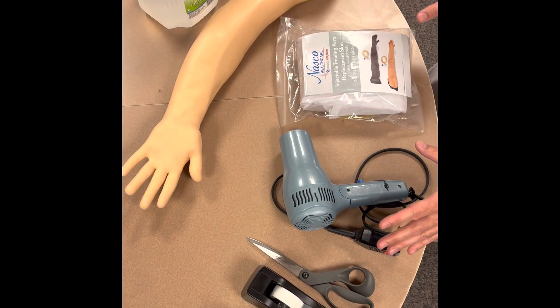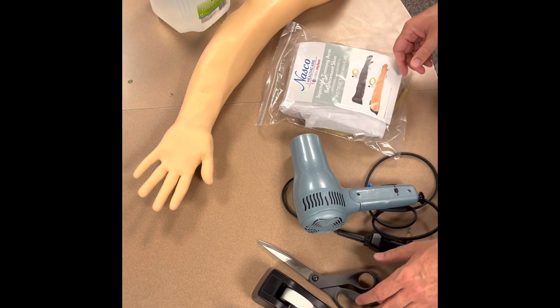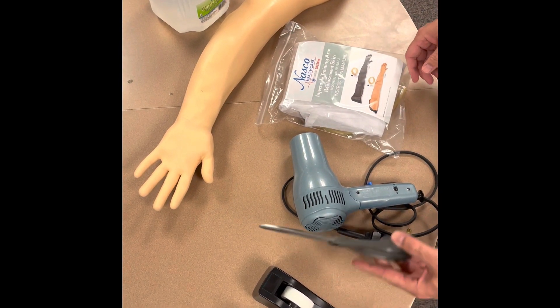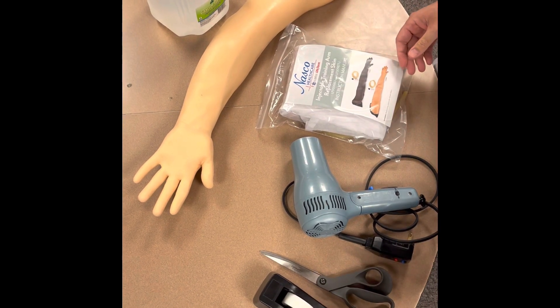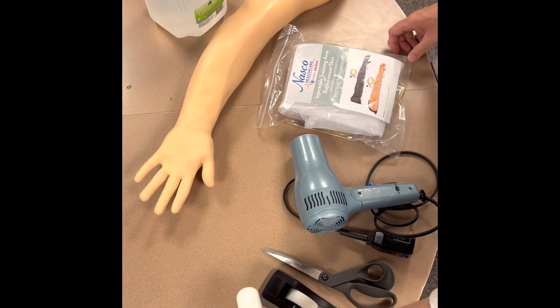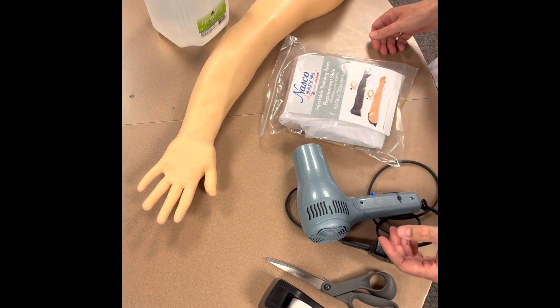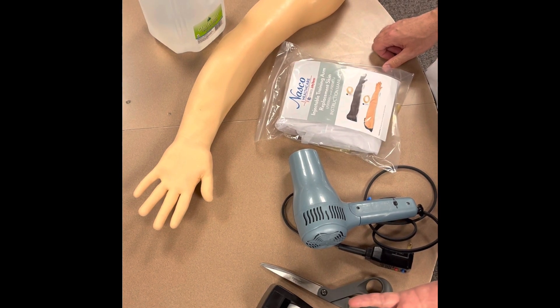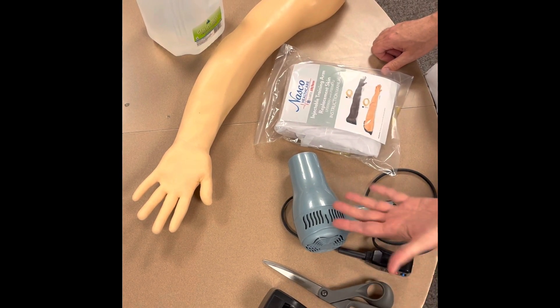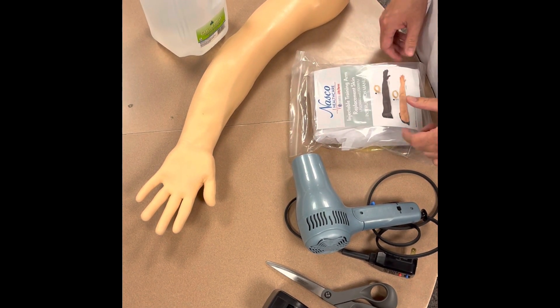Today we're going to go over replacement of the NASCO IV arm supplies for both the basic and the advanced arm — they're very similar. These are all the supplies you want to have: super glue, dish soap, the trainer replacement skin, masking tape or scotch tape, scissors, a blow dryer, your IV arm, and replacement skin.